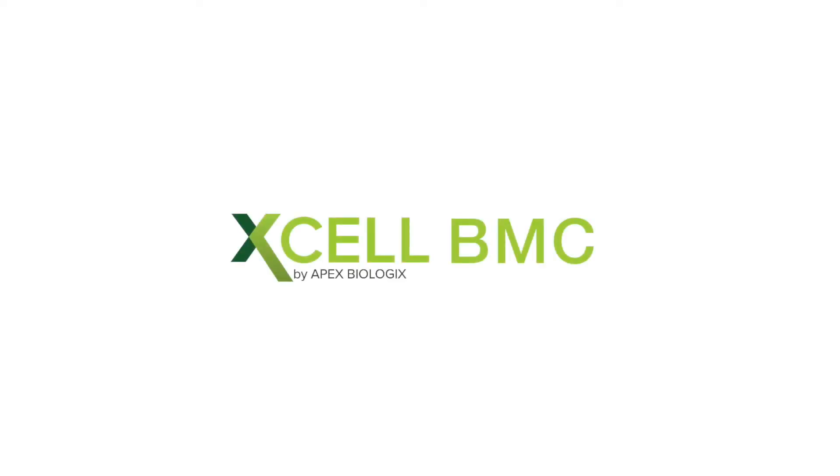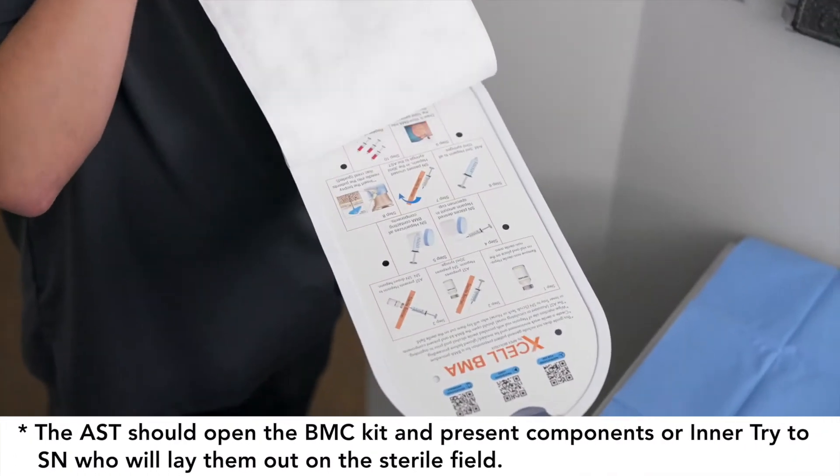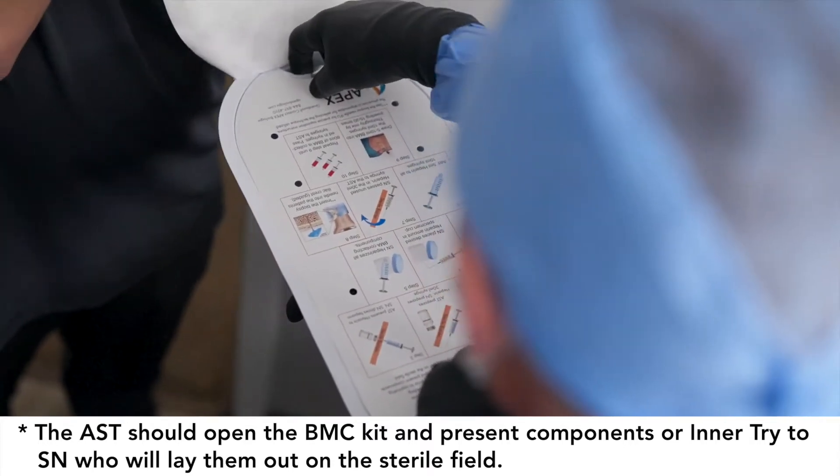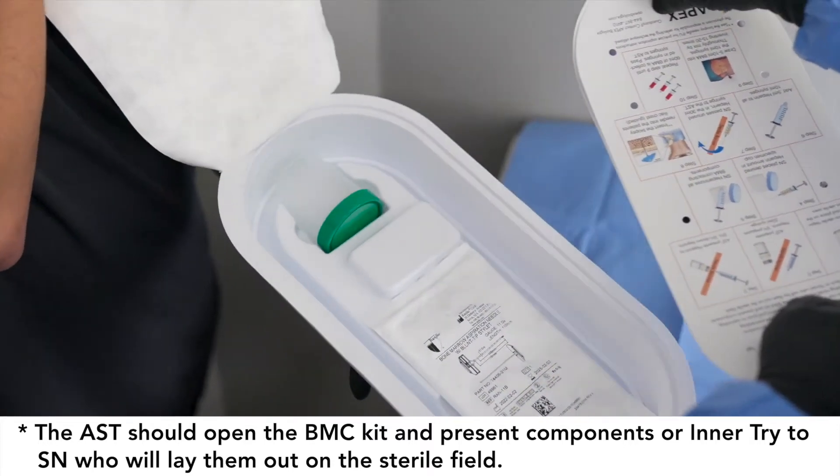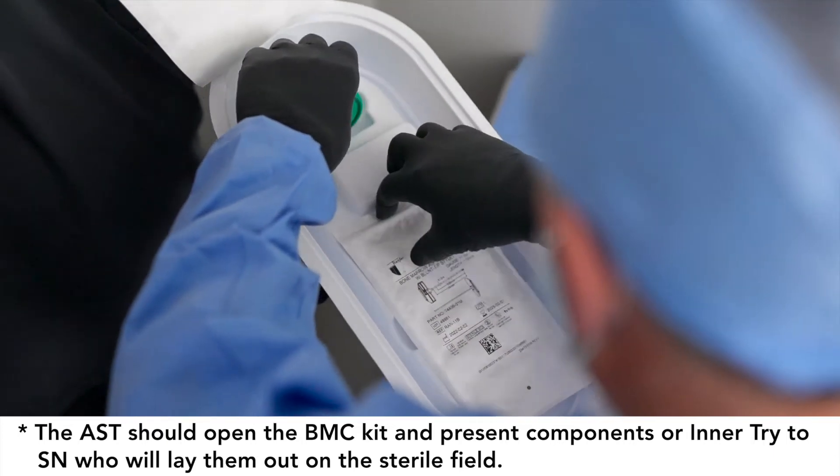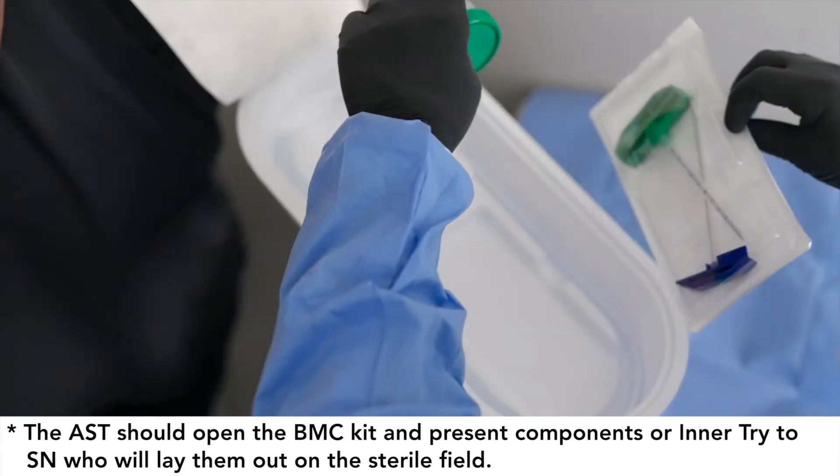All equipment used in the procedure room is understood to be sanitized to current federal standards. Create a sterile work environment and be masked and gloved before proceeding. The assistant or circulating nurse should open the XL bone marrow concentrate kit and present components of the inner tray to the scrub tech or nurse who will lay them out in the sterile field.